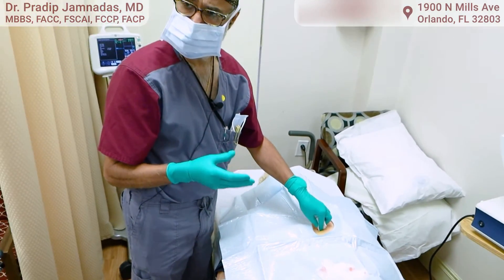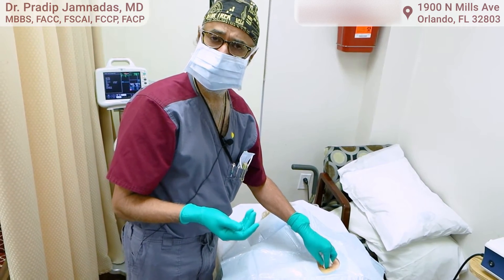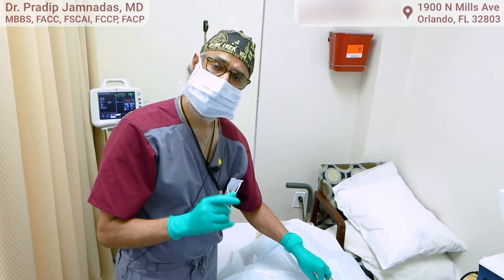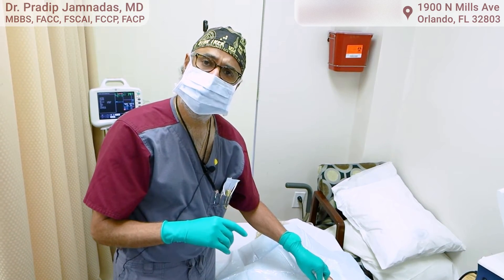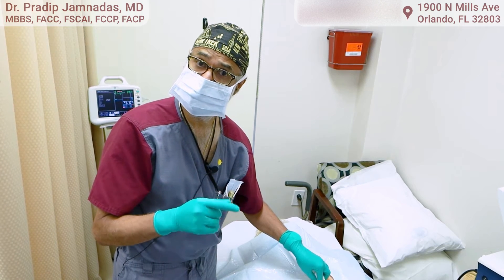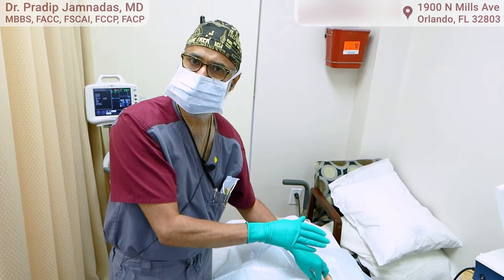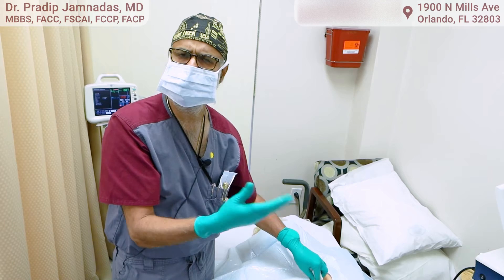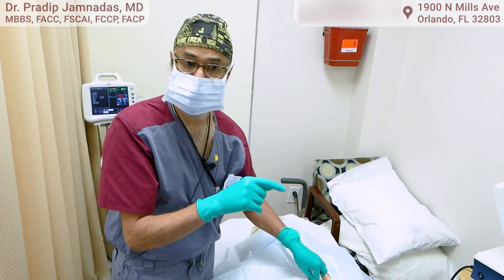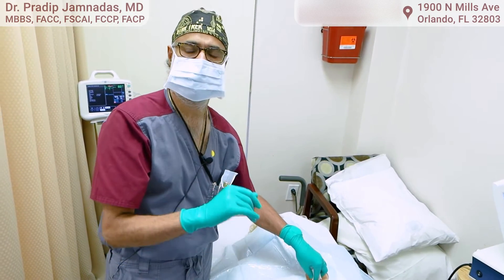It's as simple as that — a nice simple procedure that only took a few minutes. This device will be monitored from the patient's home. We give them a little device, and if they get any symptoms they can log them. We can see what the rhythm was at that particular time — so if someone has a blackout at three o'clock, we can correlate the arrhythmia to the symptom.